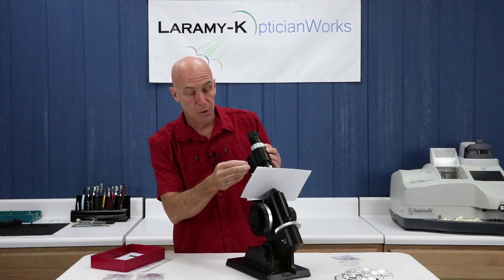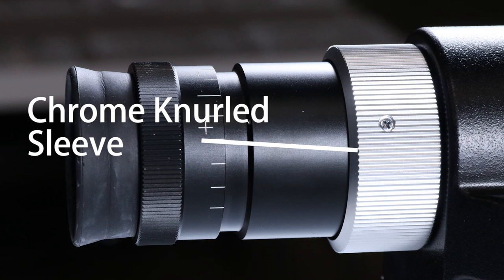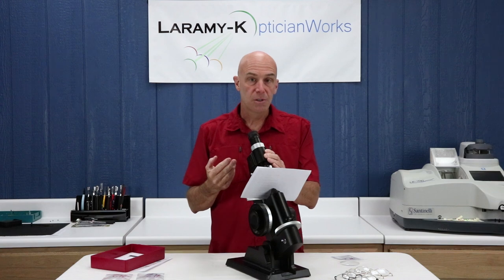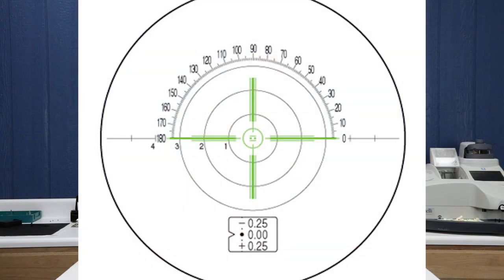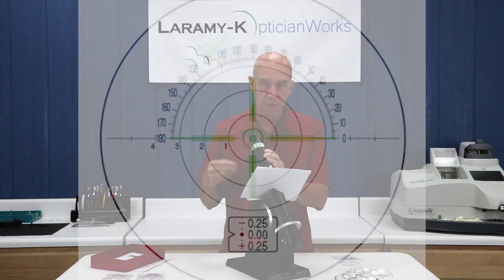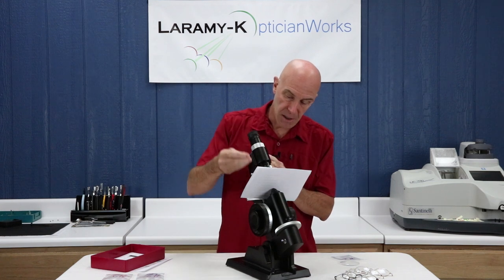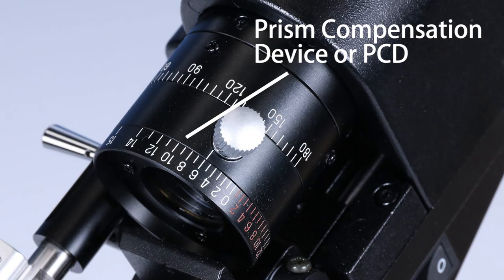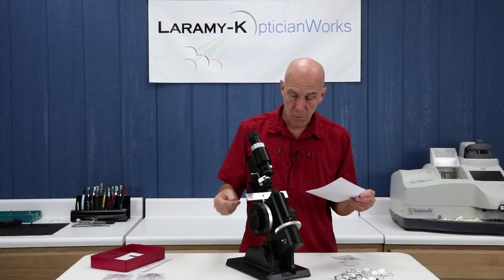Other pieces that make up the eyepiece tube include the chrome knurled sleeve — which if nothing else is a really cool name. This controls what's called the reticle, which is something you see when you look inside the instrument. We'll talk about how you use that in much more depth when we get to actually working with the lens meter. The last piece of the eyepiece tube is the PCD, or prism compensation device, which is used in a couple of different ways. We'll cover those in the how-to-use section rather than this overview.